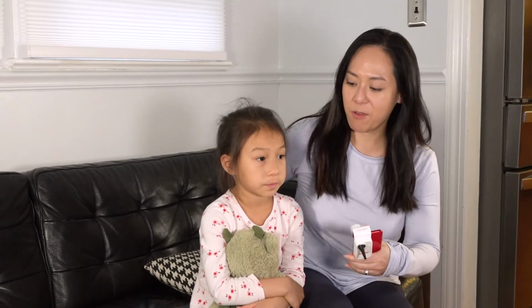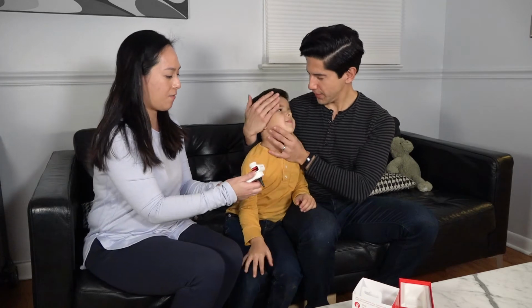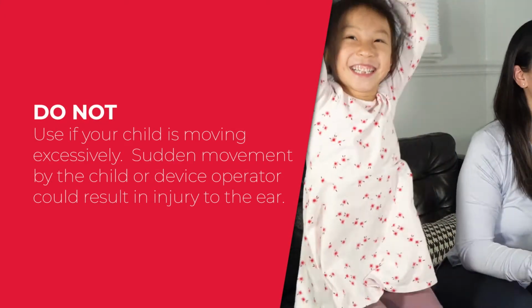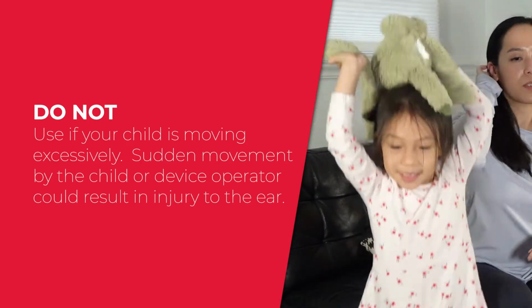For young children who may have trouble sitting still, have a second adult help hold the child's head in an upright position for the entire recording. Do not use the device if your child cannot hold still. Sudden movement by the child or parent could result in injury to the ear.